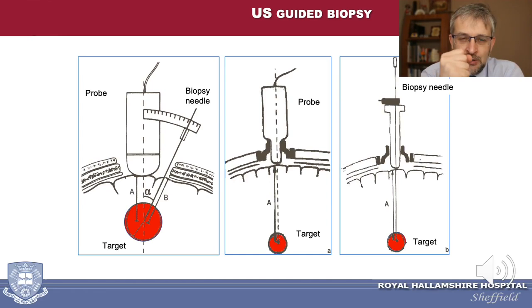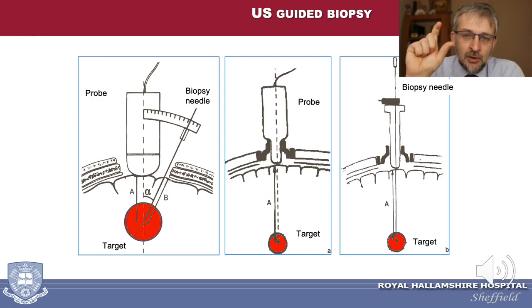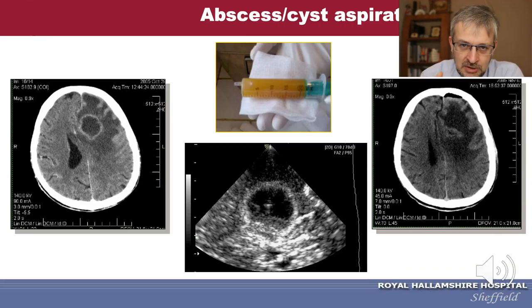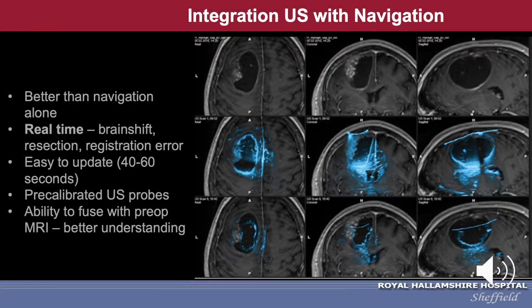A less invasive option uses a small burr hole with the burr-hole probe to identify the optimal trajectory and exact distance to the target. You then remove the probe and, using the same trajectory and distance, insert your instrument to get the specimen comfortably. This is a patient with a left frontal abscess — drainage was possible with minimal impact on normal neural tissue. You can see the needle tip inside the abscess and watch it shrink in real time. Navigation images can be misleading because they were obtained days or weeks before surgery — after craniotomy, dura opening, and CSF drainage, the brain shifts more than a centimeter, so the real-time ultrasound image is the accurate one.